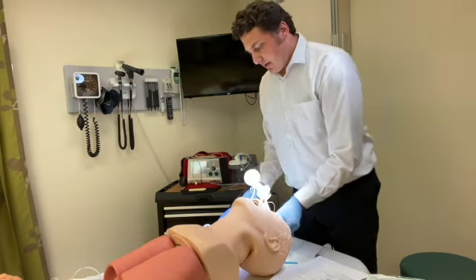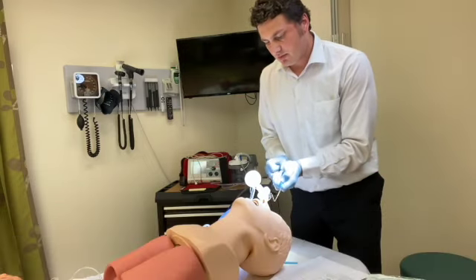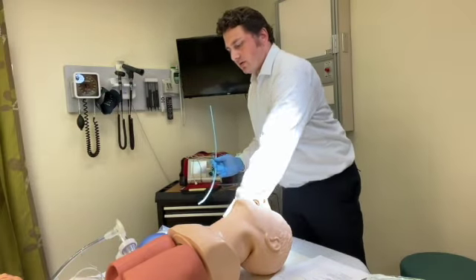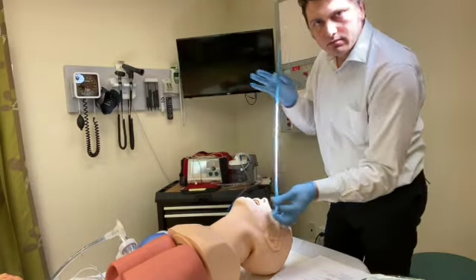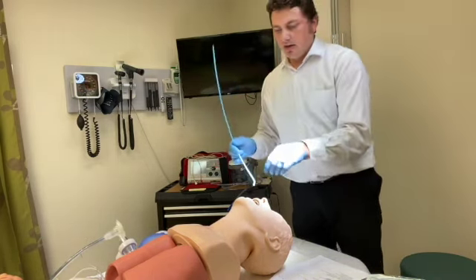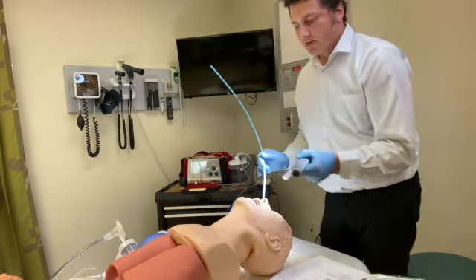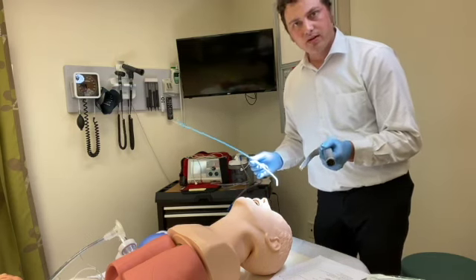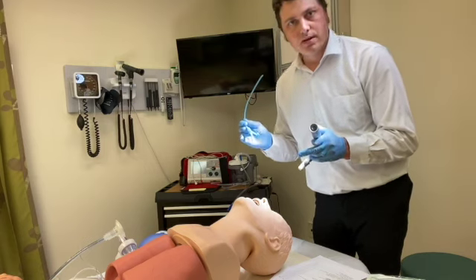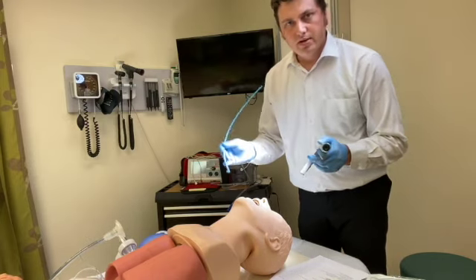Okay. Another advanced technique is using a bougie, and I'm going to remove this ET tube. So the bougie is a very long, rigid stick basically, and it has a curved tip at the end. And you will use your actual blade, and like a typical endotracheal intubation, you want to identify the vocal cords. The biggest benefit is that it's smaller and it might be easier to fit in. The other thing is you might be able to also feel the tracheal rings on this.